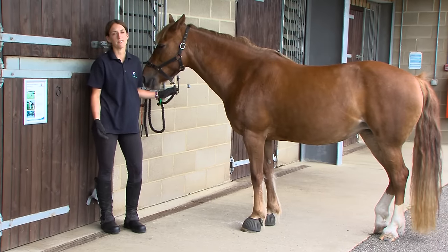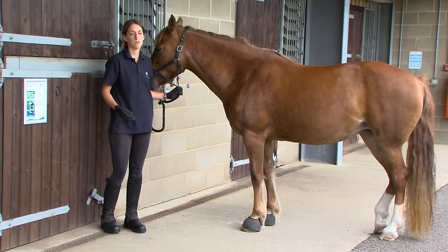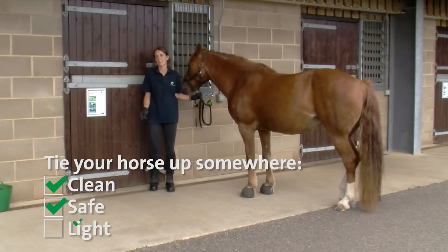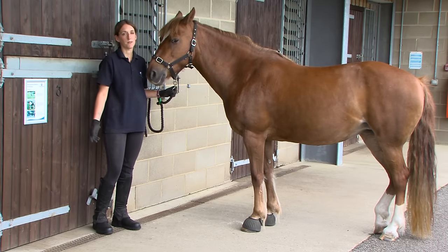Where you choose to take your horse's temperature will vary according to your own facilities at home, but it's really important to do it somewhere that's clean, safe, free from any hazards, and somewhere that's light. Today we've tied Honey up, but you might choose to have somebody hold the horse for you.